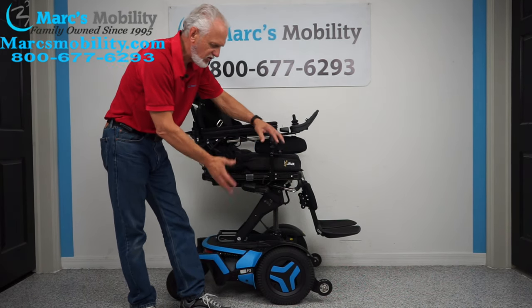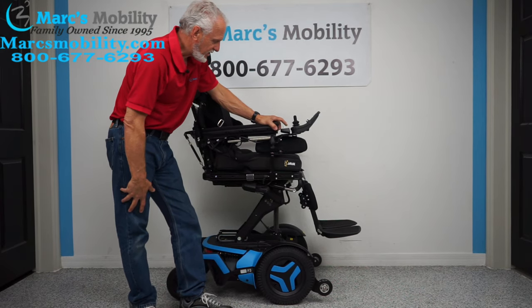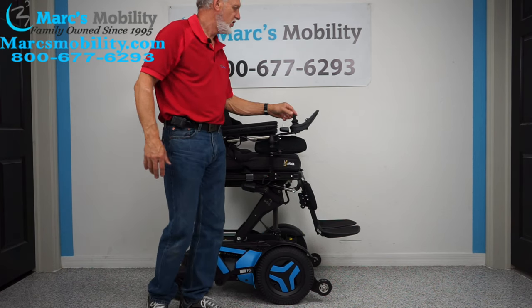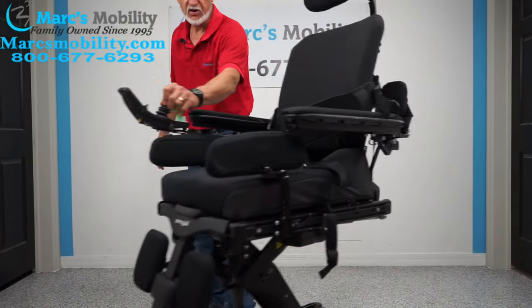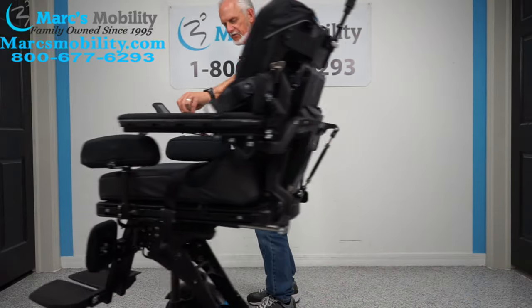Also with this you can do your dishes, you can reach the second cabinets — there are all kinds of benefits with the seat elevation. The nice thing about this chair is that when the seat's elevated, you can still drive the chair. You can see the chair moving at a decent speed with the seat elevated.